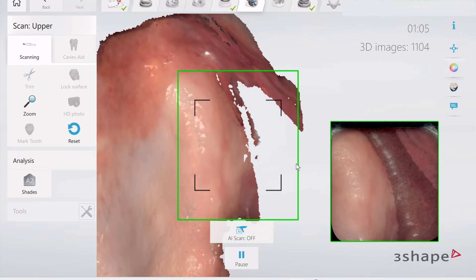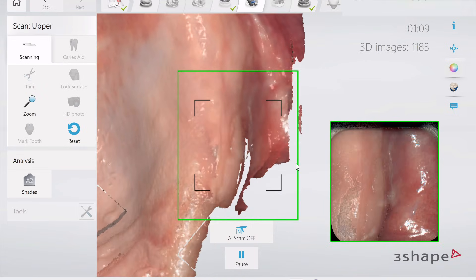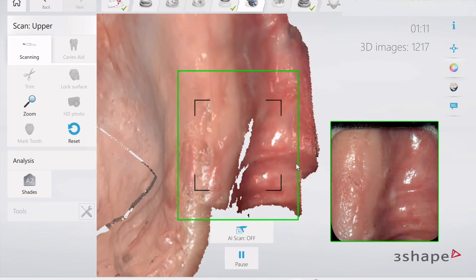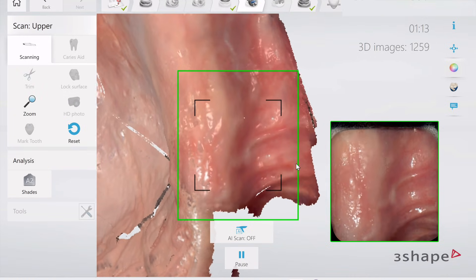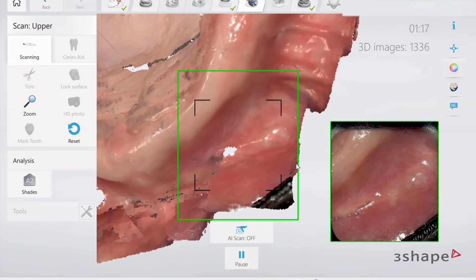Now that I have one side, I'm going to go to the hamular notch of the contralateral side where the retractors are in place. They go all the way back to the hamular notch. They push the buccal fat pad out of the way, and you're going to see our buccal frenums are going to be stretched from the buccinator muscle there.